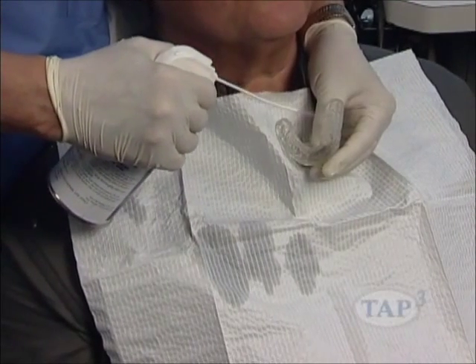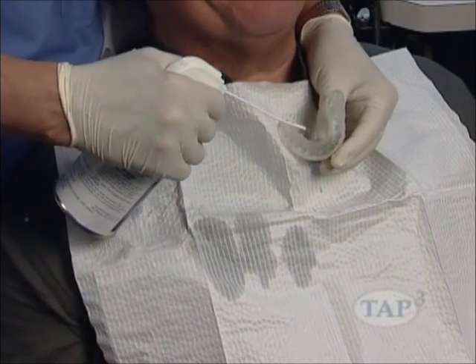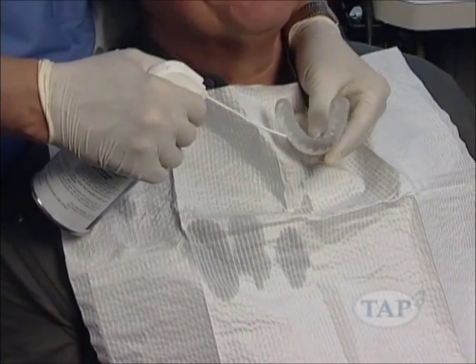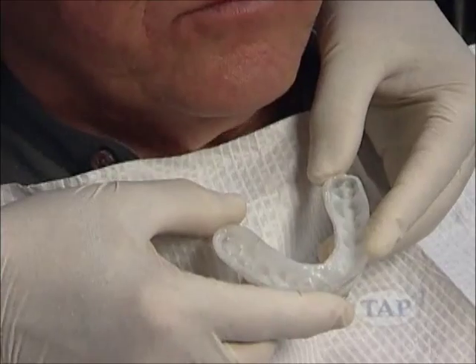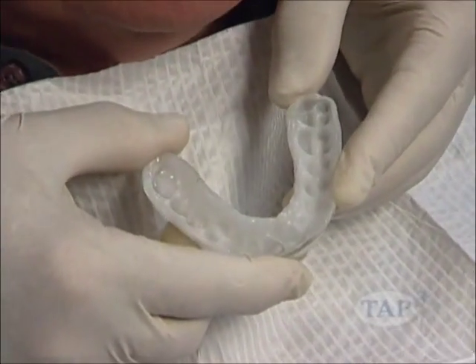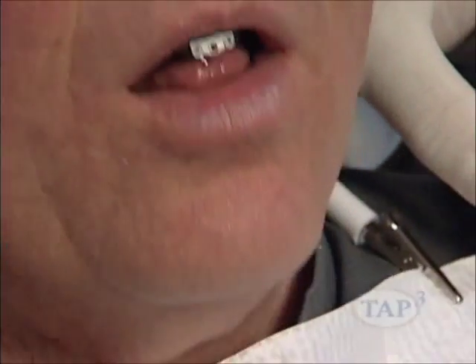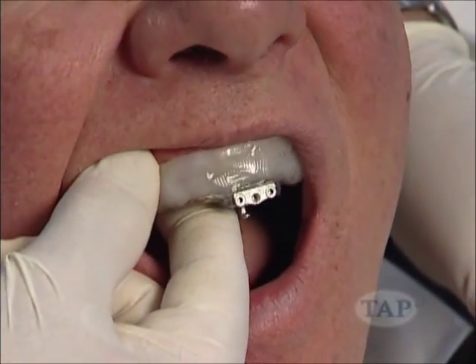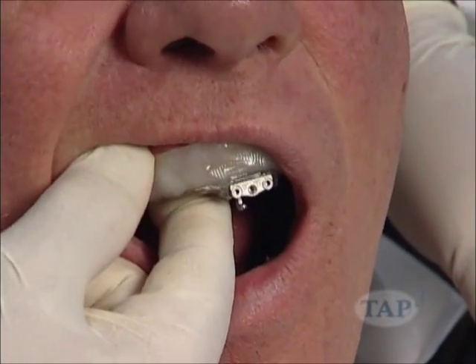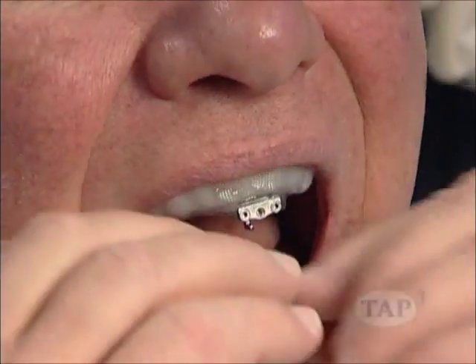Cool with Insta-Cool spray, or place in cool water to set the thermocryl. The thermocryl will turn white and become hard. Have the patient place the tray back into the mouth. Check for fit, comfort, and retention. The thermocryl will continue to set for 15 minutes and shrink slightly, which will increase the retention.